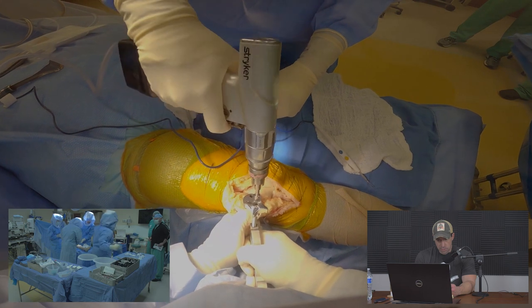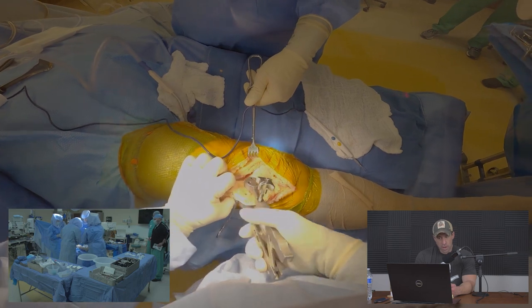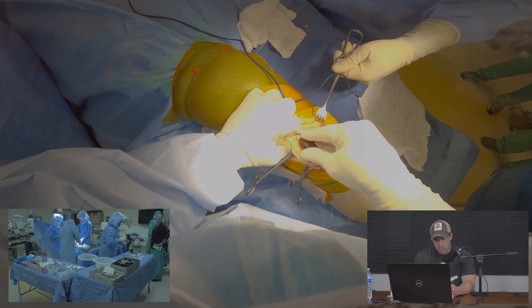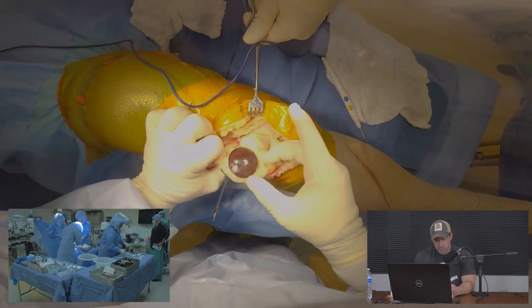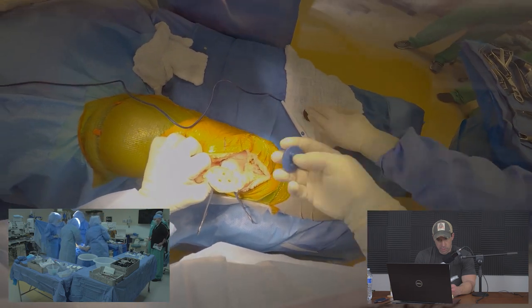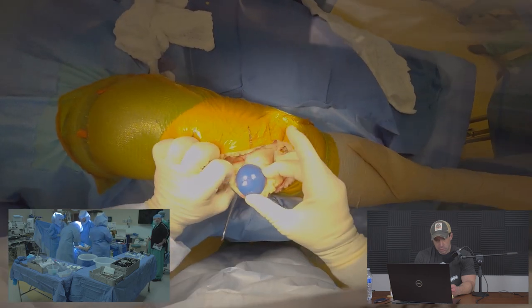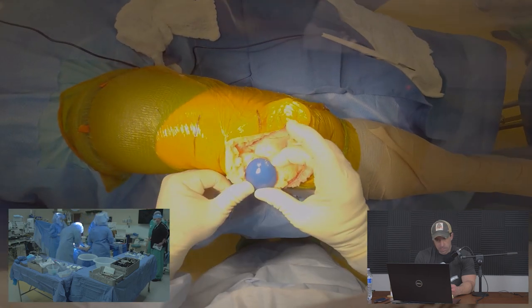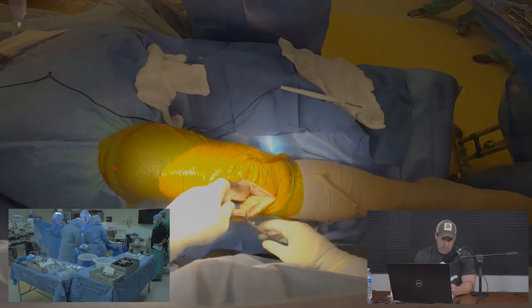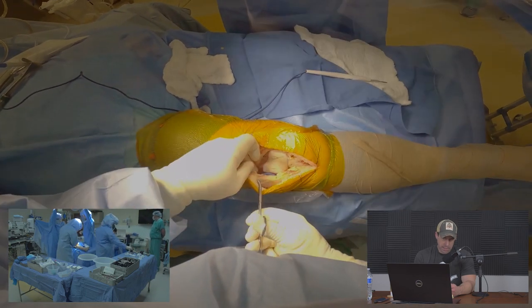My assistant prepares the drill holes. Trial implants are applied to verify the correct size — we want coverage of the posterior patella without overhang. We select a slightly different size which covers appropriately without overhang. The patella is then subluxed and tucked into the lateral side of the knee.